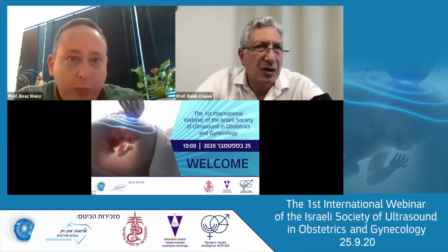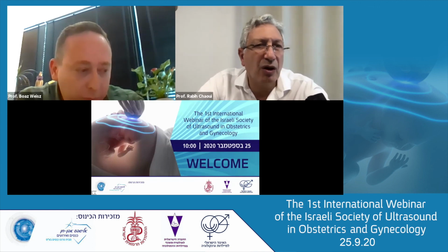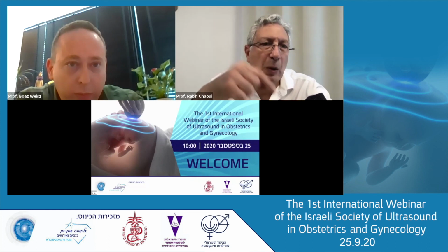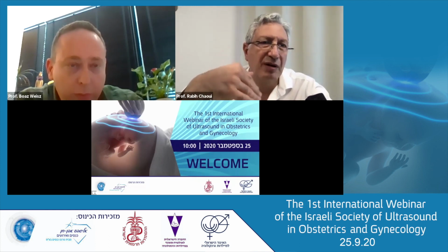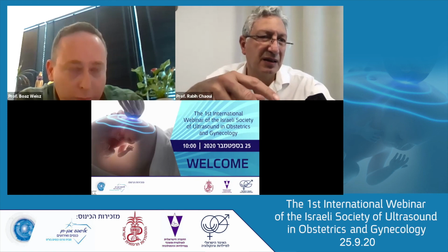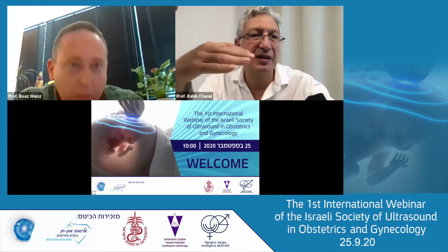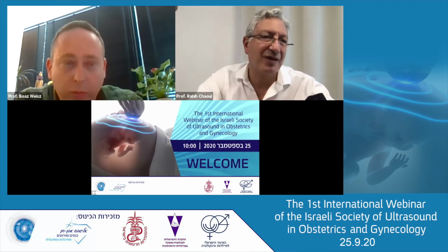Not really, because my prognostic sign is rather the color Doppler and how the flow is during the complete cardiac cycle. If you have, in later gestation, more reversal flow in the arterial duct, then it's going to be a blue Fallot. If it's antegrade in both systole and diastole, then you will have rather a pink Fallot.